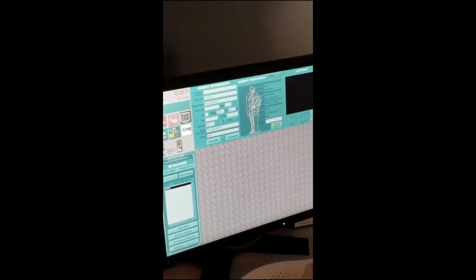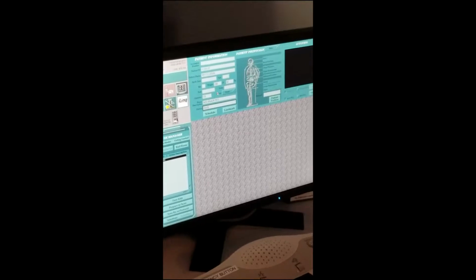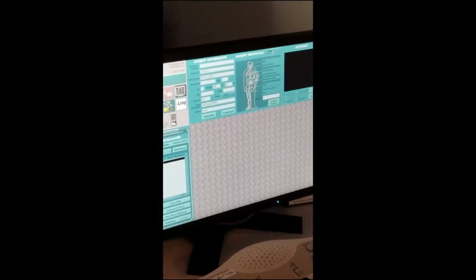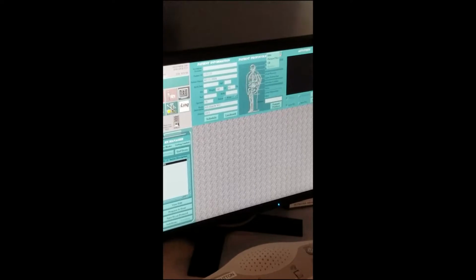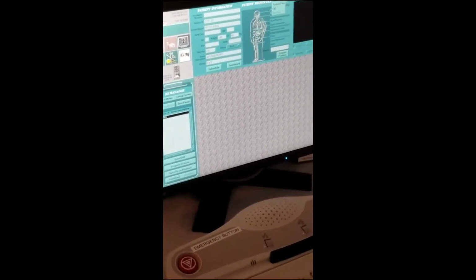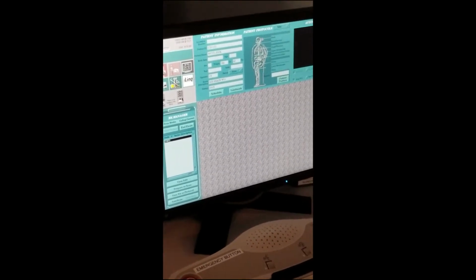Wonderful. Very nice. Okay. So now it always needs to be at site, because besides site, click on it, click that little arrow. It also has GE. But we don't want GE unless you want to go see what GE recommends. So we want to go to the site. Site protocols. So then you click on brain or the head, whatever.